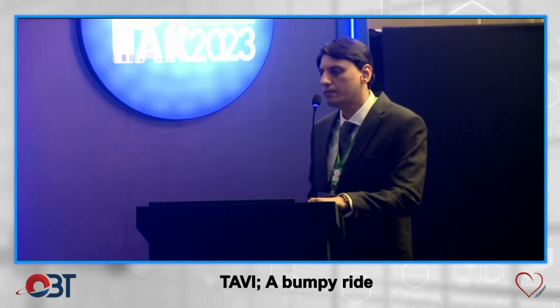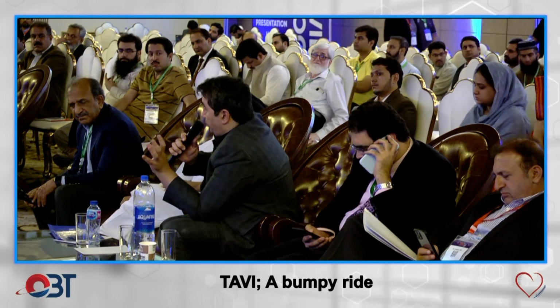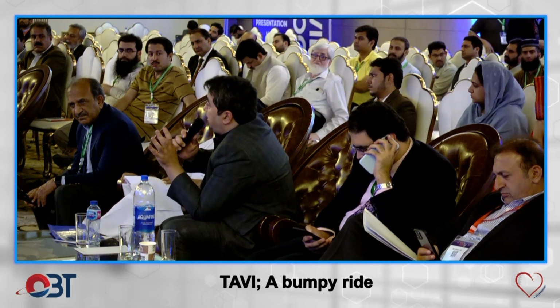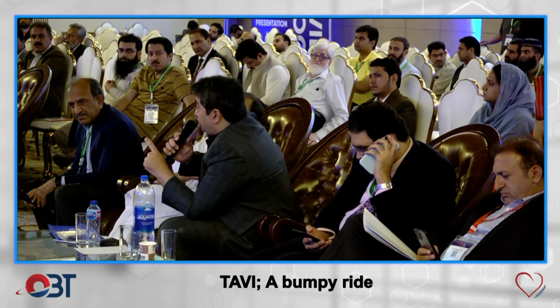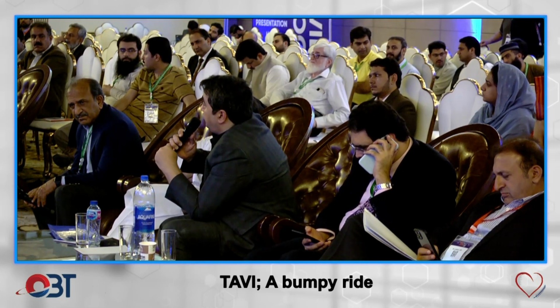We should, so that's one thing. And the second thing is this, that you should have paced it much more rapidly. It was paced at 110, so it should have been paced at 180. So you should pace it rapidly, and it will prevent the balloon from slipping.